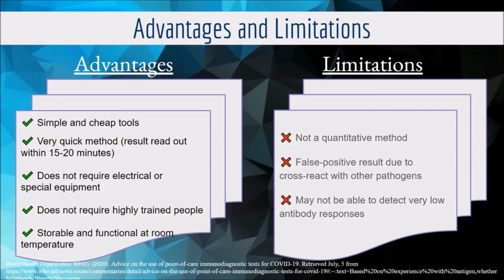Next, for the limitations of rapid diagnostic tests, the first limitation is we cannot get the exact statistical data as RDT is not a quantitative method. A quantitative method is more precise as we can generalize the whole sample population and help with the decision making.